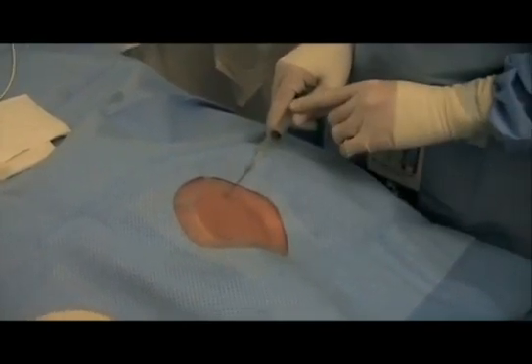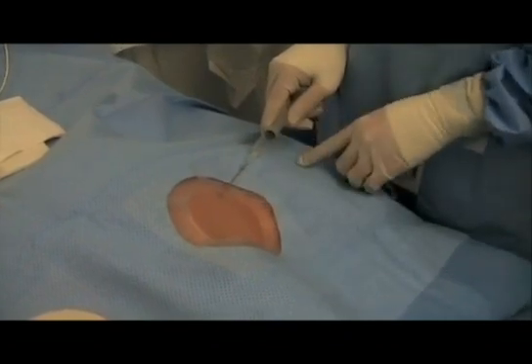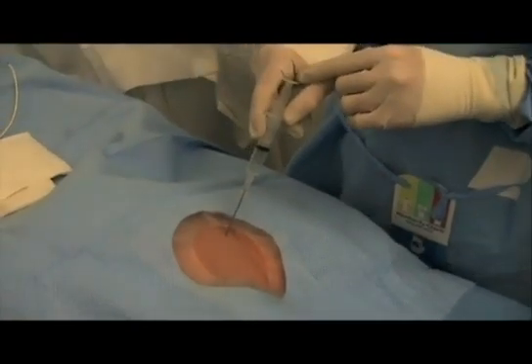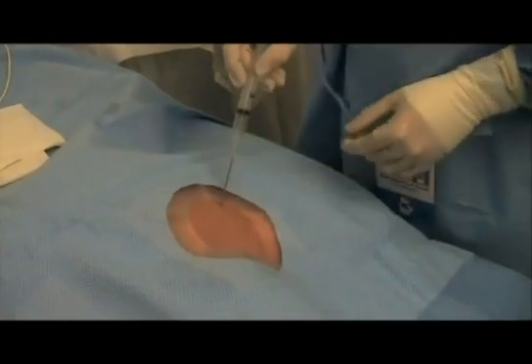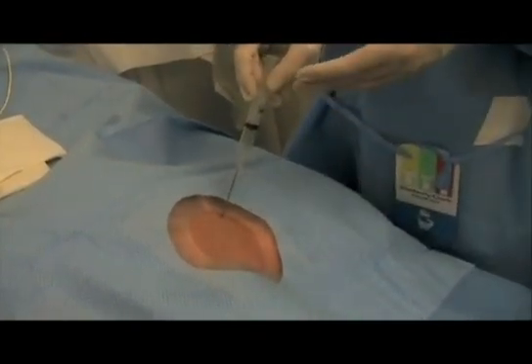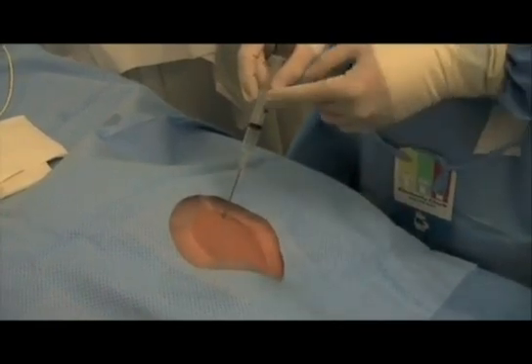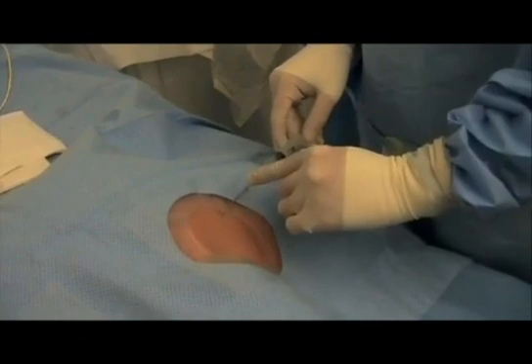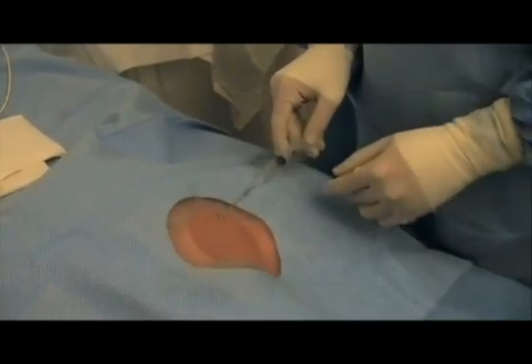You'll see my needle is actually parallel to the ground. The biggest mistake with a subclavian is to raise the back of the syringe even the slightest bit off the horizontal. If you start doing things like this, this is where pneumothoraxes get started — that motion right there. So the whole time you're directly parallel to the ground and just aiming towards your sternal notch.